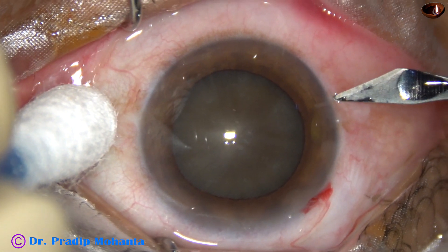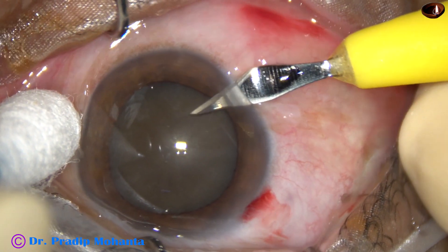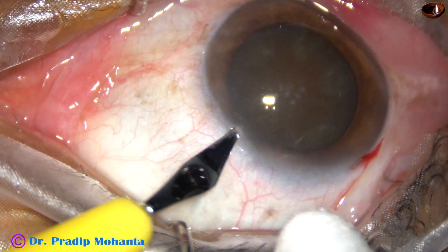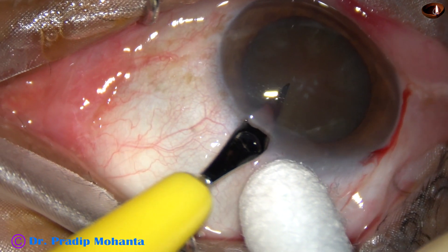Main incision has been made. A side port on the right side of the main incision, and this is another side port on the left side of the main incision.